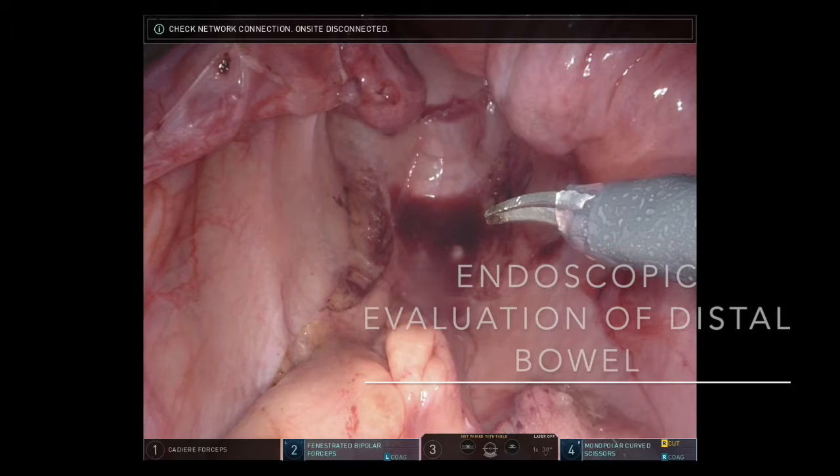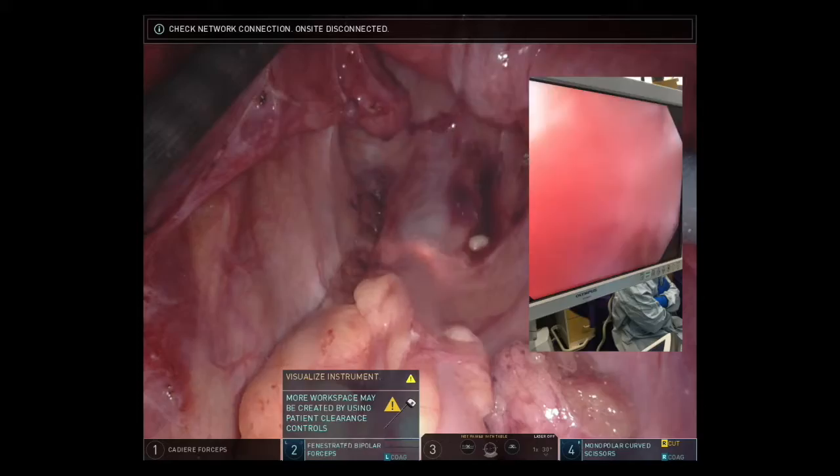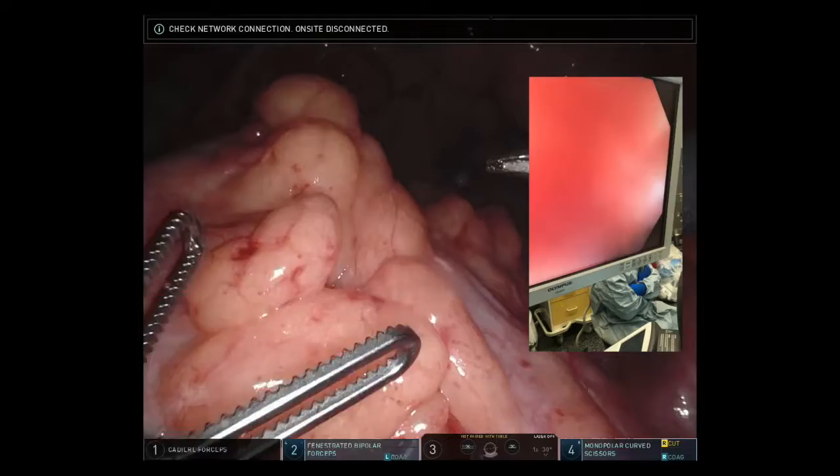We inserted a flexible endoscope to evaluate the mucosa of the distal bowel. The endoscope passed relatively easily, although there was some extraluminal compression by adhesions. For the most part, the mucosa of the distal bowel was healthy and pink.